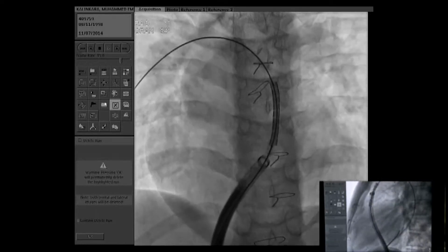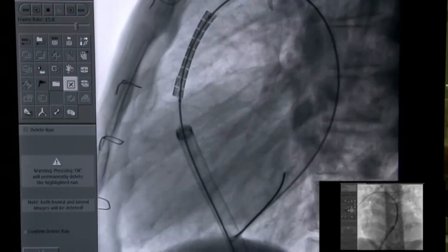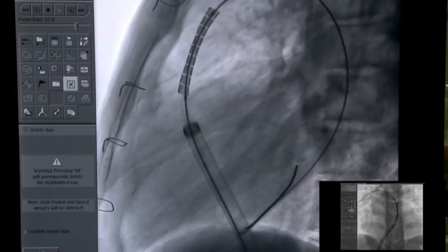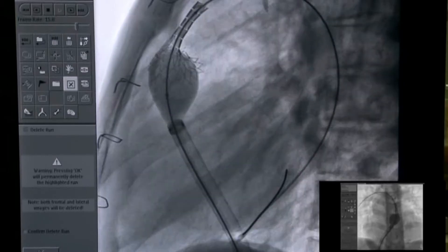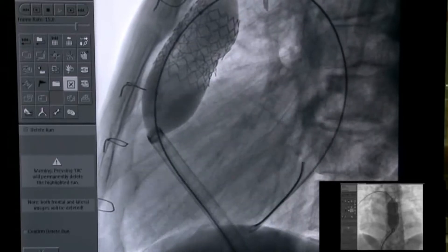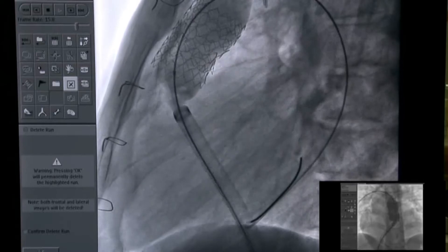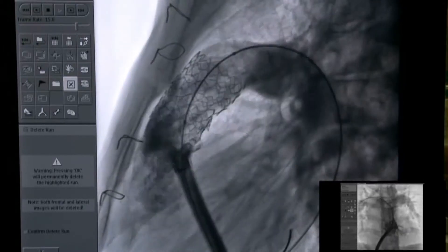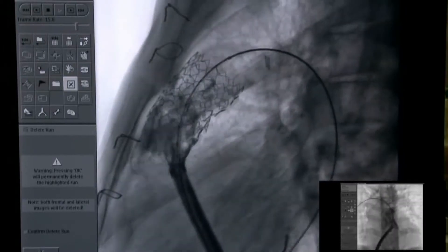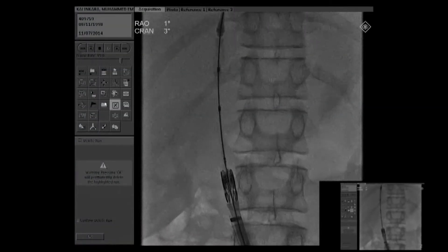We approximate the indentation as you see on the AP position, just below the second. The mounting of the stent was not perfect on the balloon — a little bit was off. No, I think it was perfect. We did it intentionally. We then flared the distal portion as well.